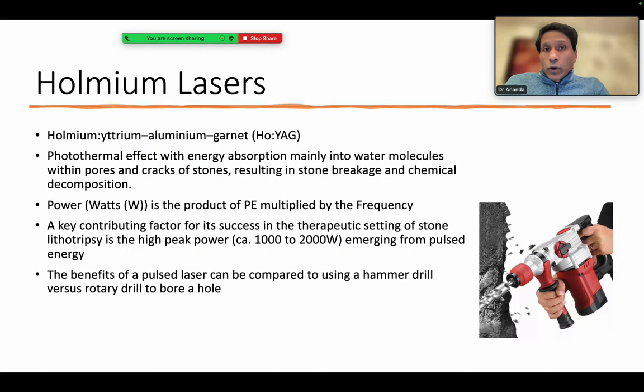We all know that the holmium laser has become quite standard. Gone are the days when people were using lithotripsy via thin lithotripsy probes into the ureteroscope. For any upper tract or ureteroscopy, holmium laser is the go-to energy source. Of course, for PCNL, we have other modalities like, for example, Trilogy, etc. For the bladder, we can still use the age-old gold standard stone punch, etc.